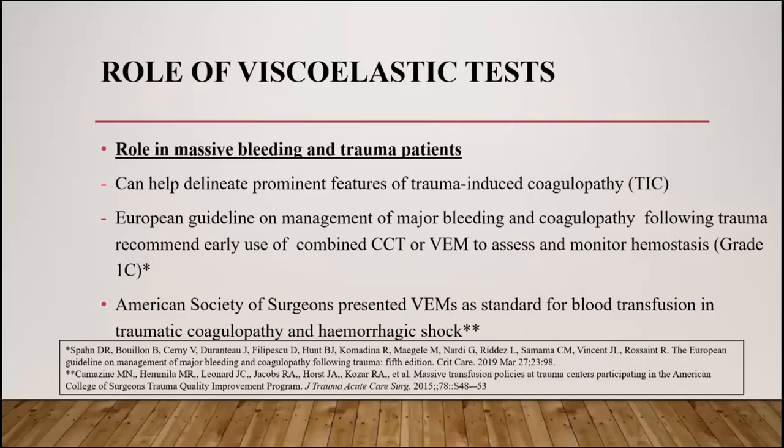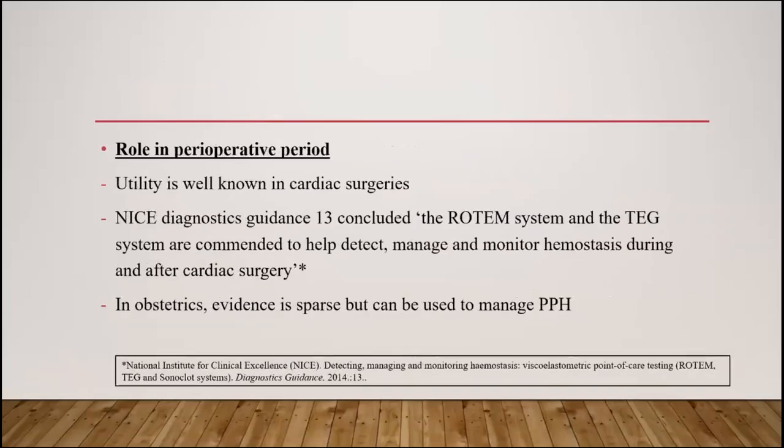The European guideline as well as the American Society of Surgeons recommend the use of viscoelastic tests not only to assess and monitor the hemostasis but also for regulating the blood transfusion in traumatic coagulopathy. The role of TEG and ROTEM in cardiac surgeries is well known, and NICE diagnostic guidelines also recommend the use of ROTEM and TEG for detection, management, and monitoring of the hemostasis not only intraoperatively but also in the postoperative period.